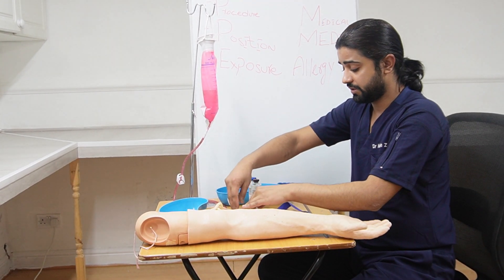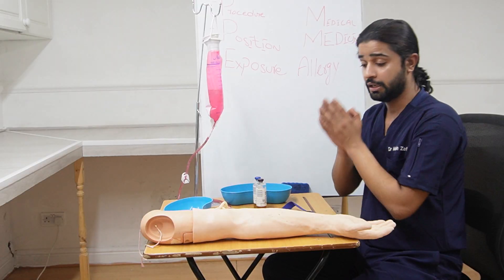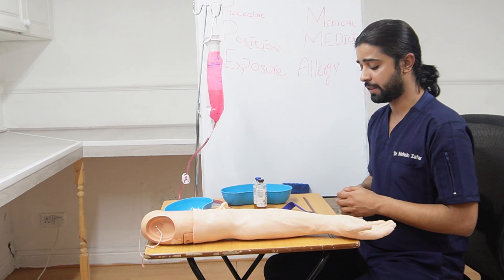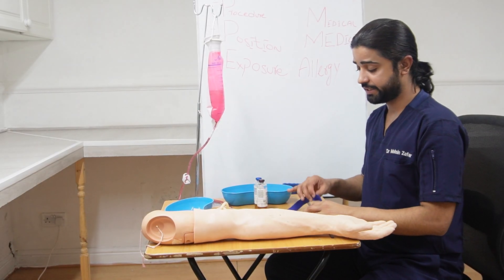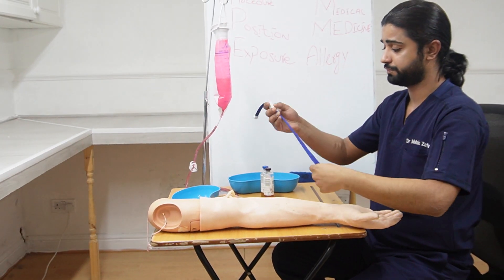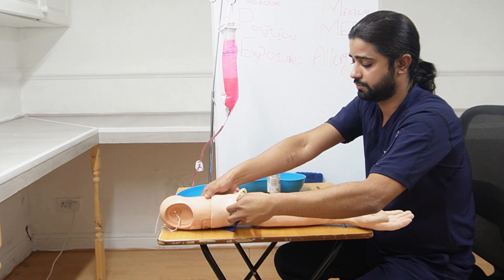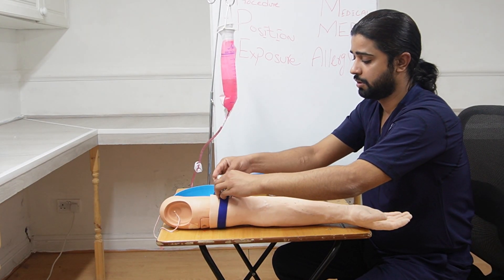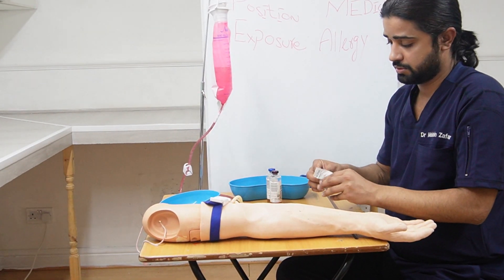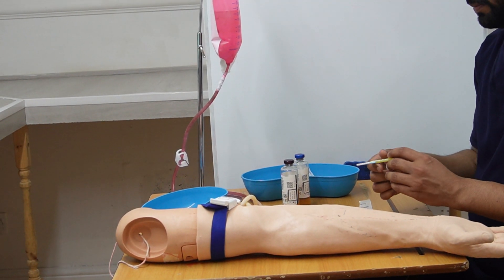Now you are going to start your procedure. You need to wear gloves — if gloves are provided, wear them; most of the time it will just be written as 'wear your gloves.' After that, first feel for the vein, then tie the tourniquet, and then you are going to clean the area with a single stroke of the alcohol swab like this.